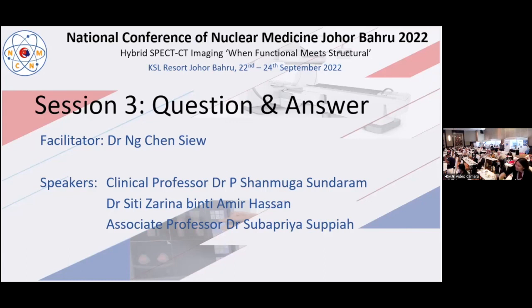My concept is slightly different from what is being discussed. I believe strongly, when we are having a PET-CT, see the configuration of this equipment supplied by our vendors. It is 64 slice, 16 slice, 128 slice. So when you are having such a high-end CT with you, you should use it as a real contrast CT. You should try to give all the information that my radiology colleague can give.